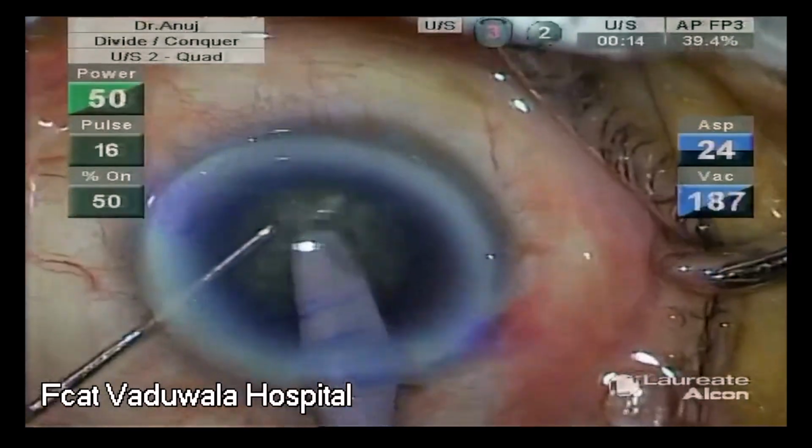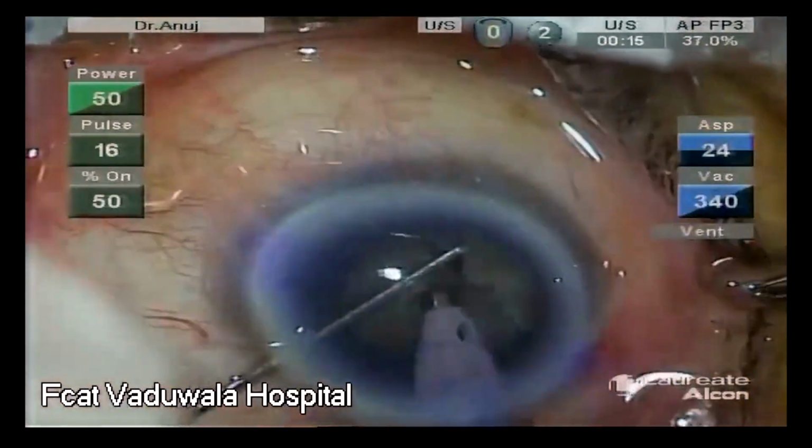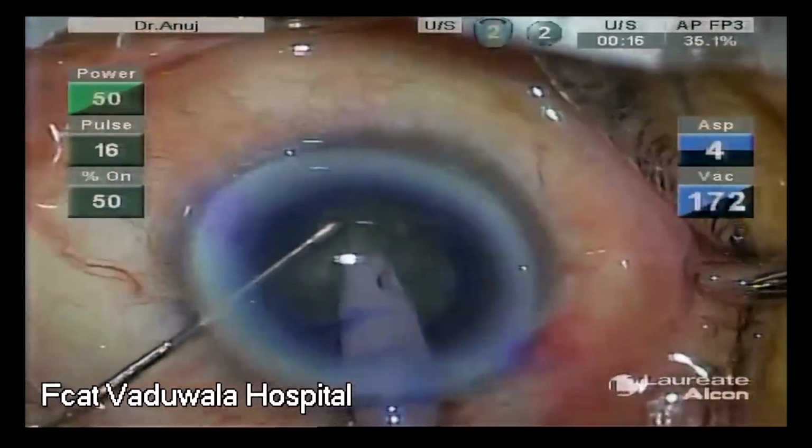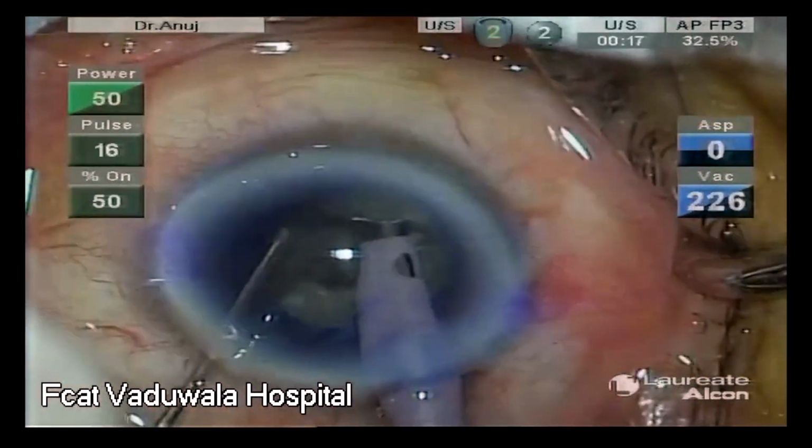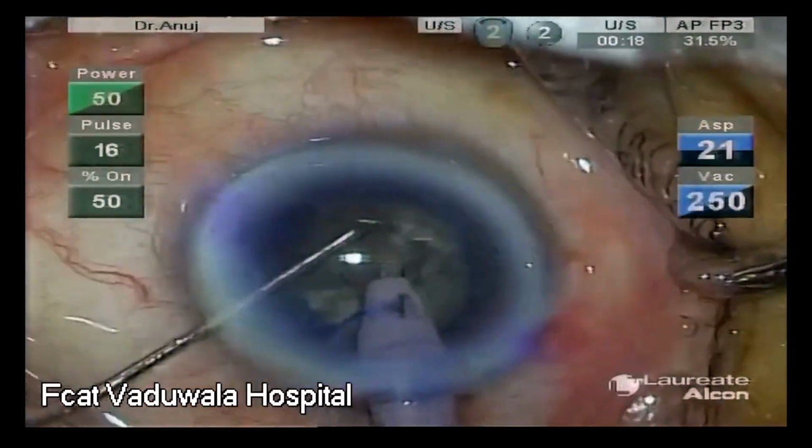This technique is pupil independent as only the central nucleus core is attacked here. So cases having small pupils or a compromised view in the periphery are best served using this approach.